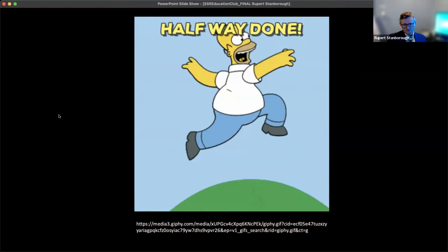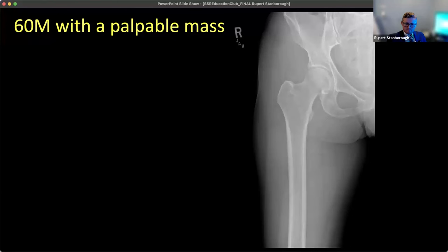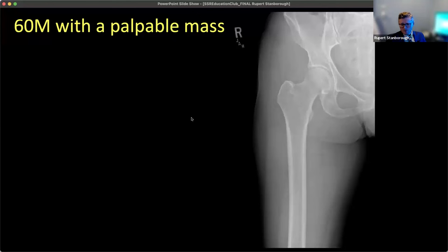Halfway done. Moving on — a 60-year-old man with a palpable mass in the medial right thigh. There's nothing to see on the radiograph, which I'm showing because in practice we always get radiographs when reading MRIs for soft tissue and bone tumors, but soft tissue tumors often don't show anything. Let's skip right to the MRI: coronal T2 STIR, T1, and post-contrast images of the thigh.